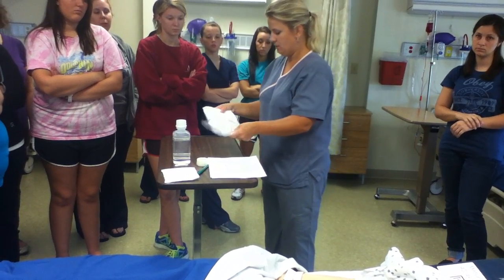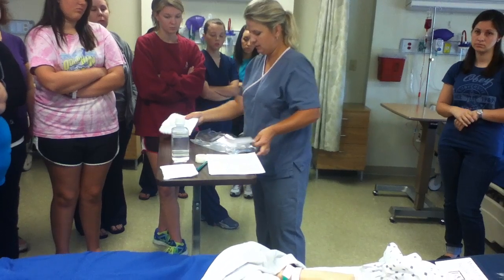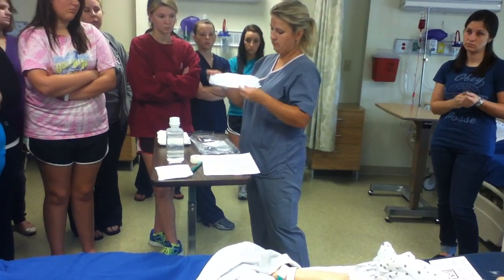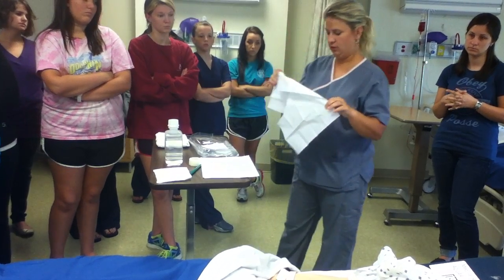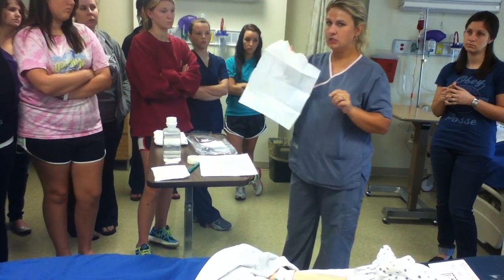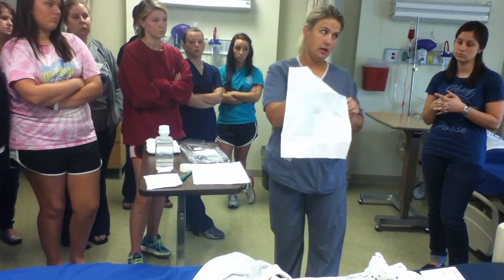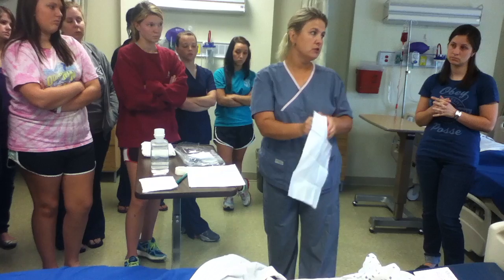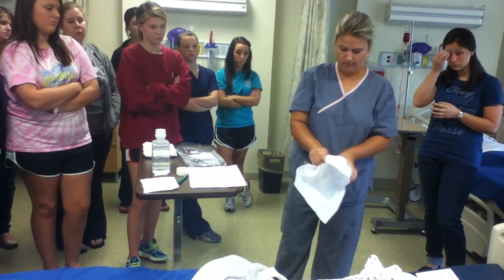Okay, so now we are going to remove this. Let me talk to you guys real quick about a couple things. This right here, this bag is included. I strongly suggest you not use this bag. I'm going to show you what you can do with it, but I'm also going to tell you what happens.